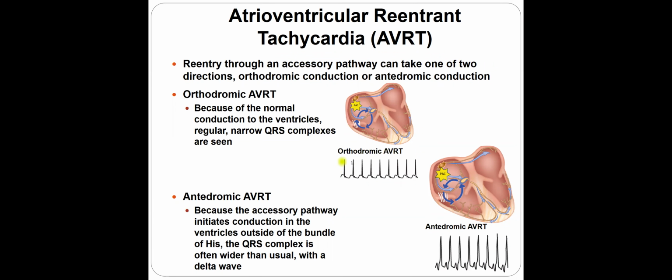One type is when we have a narrow QRS complex, completely narrow, and it looks like a supraventricular tachycardia. You don't see the delta wave because the accessory bundle is only taking the charge back up, okay? That's an orthodromic one. And when the ventricle is activated through the bundle of Kent, through the muscle, you have a wide QRS tachycardia. And that's the antidromic AVRT tachycardia.